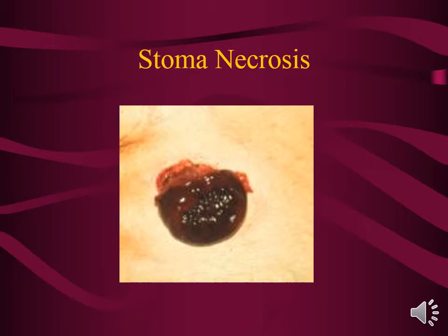So if it just starts to turn a little bit, then maybe it is going to pink back up, and a little bit of the necrotic jelly tissue will just slough off. But in this particular case, we've lost blood flow and we've got to go back to surgery.